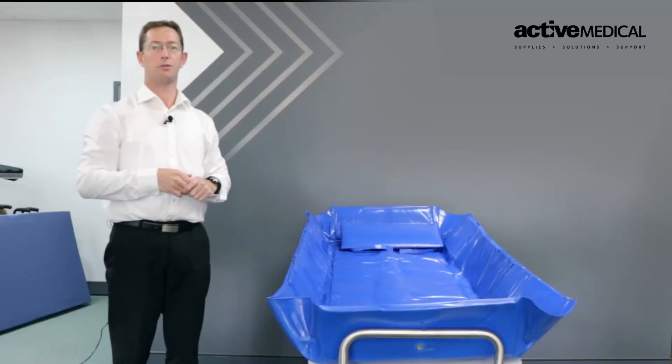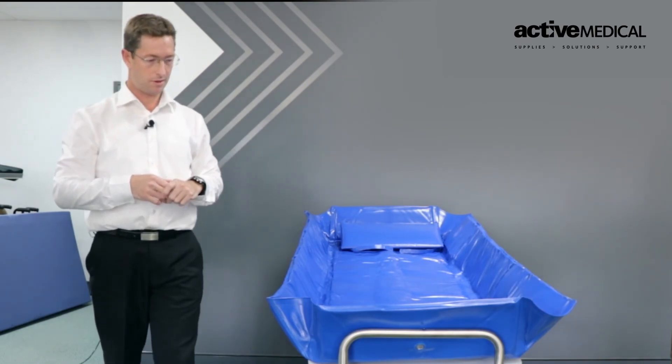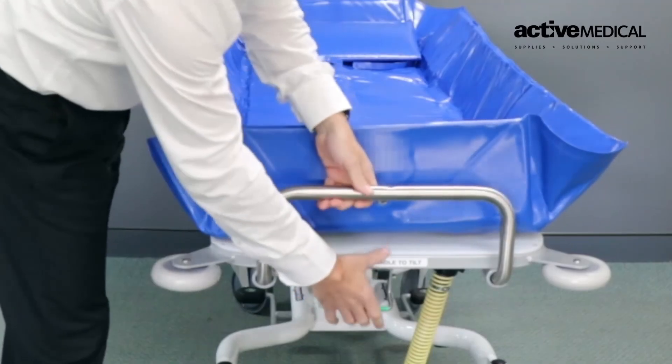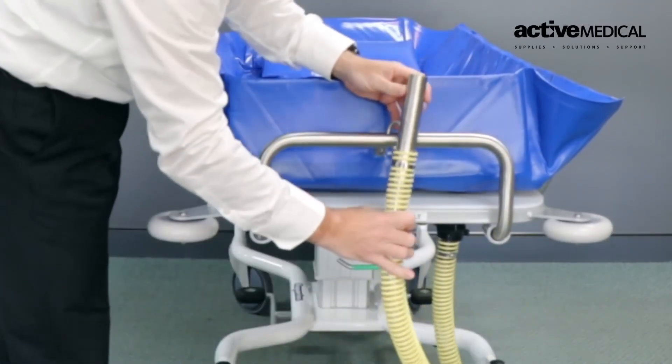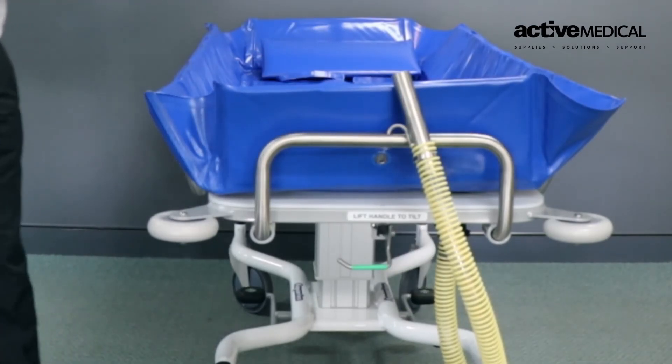We now have a few degrees of angle to ensure the water freely flows over the patient. To raise it back up, simply take the handle, raise it back into position, and put the hose back in the correct position to transport it out of the room.